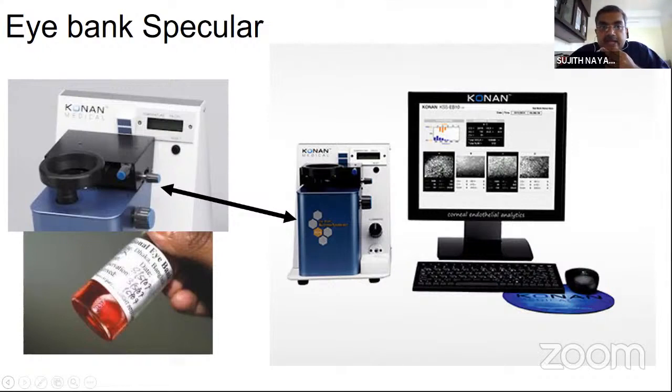And this is a picture of an eye bank specular. In the eye bank specular, you have a corneal button in the MK media or whichever preservative medium is there, and you keep that bottle in the specified area. Just like normal clinical specular microscopy, the computer captures the various qualitative and quantitative measures of the endothelial cells.